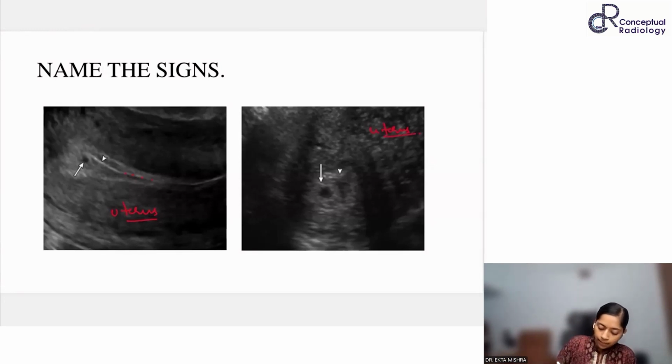If you notice, a small cystic area in the endometrium, but not exactly in the endometrial cavity. So what is this echogenic area? This is the collapsed endometrial cavity. So it is located on one side. So this is a cystic structure. Now this presentation is having a classical name. And as it ages, after some time, you see two rings.